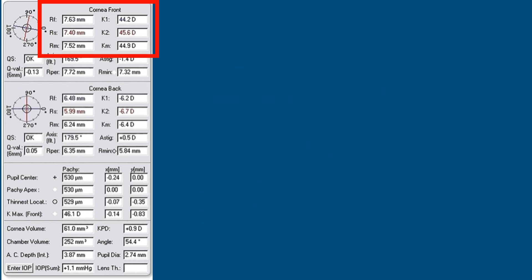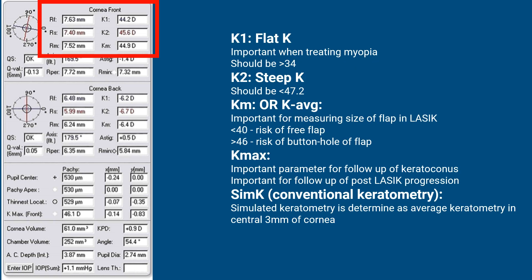There are some parameters in the top right-hand corner. K1 is the flat K, K2 is the steep K, and KM or K average is important for measuring the size of the flap in LASIK — less than 40 is a risk for a free flap and more than 46 is a risk for a buttonhole in the flap. Kmax is the maximum curvature; it is important for the follow-up of keratoconus and for post-LASIK progression.